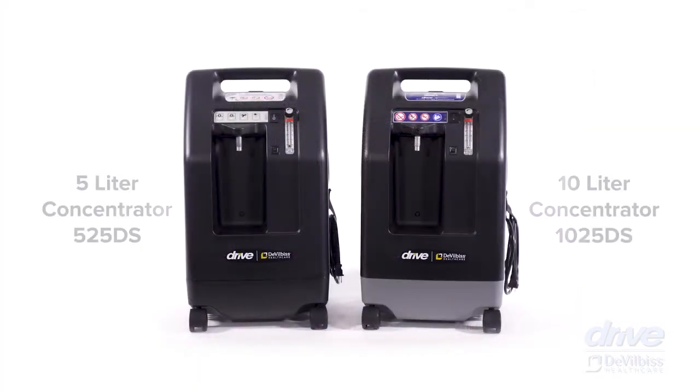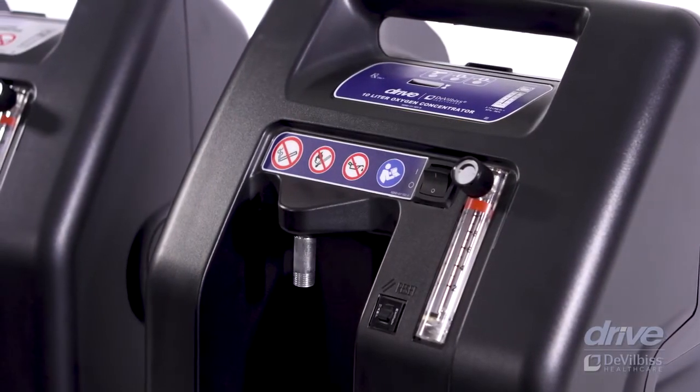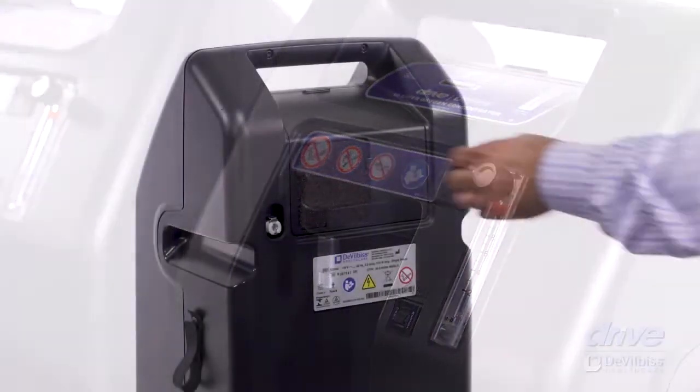As you can see, the base of the unit and the labeling are visually different on the 10-liter Drive DeVilbiss 1025 DS Oxygen Concentrator. However, the main parts of your unit, such as the power switch, flow meter, and flow meter knob location, are the same. The operating lights differ slightly. Please refer to your product usage instructions for full product information, cautions, and safeguards.